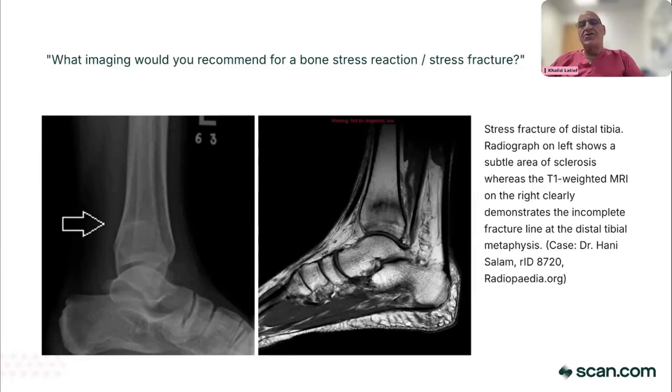I was talking to a company that's supplying our scanner, and they do a small scanner, which is the extremity scanner. So a lot of trusts are buying those scanners so they can get the wrist and the small joints off the main scanners and into these scanners. So look for stress fractures. Save that time for the patient and for the clinicians.